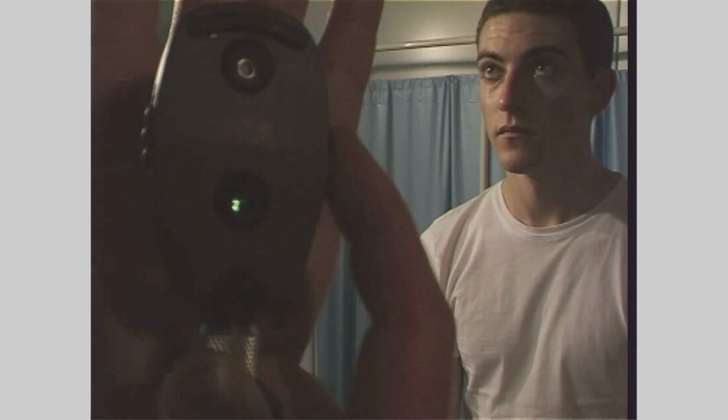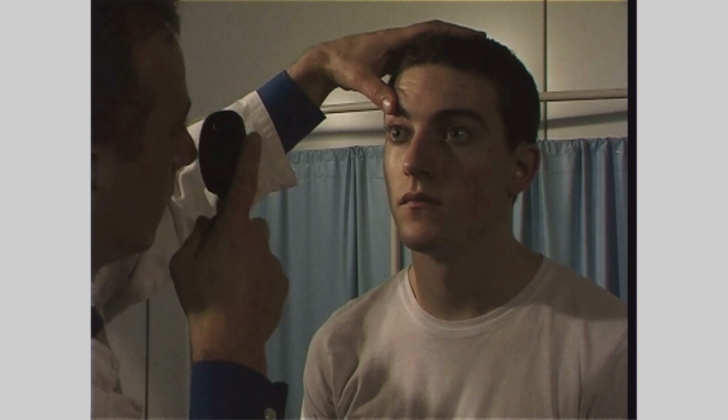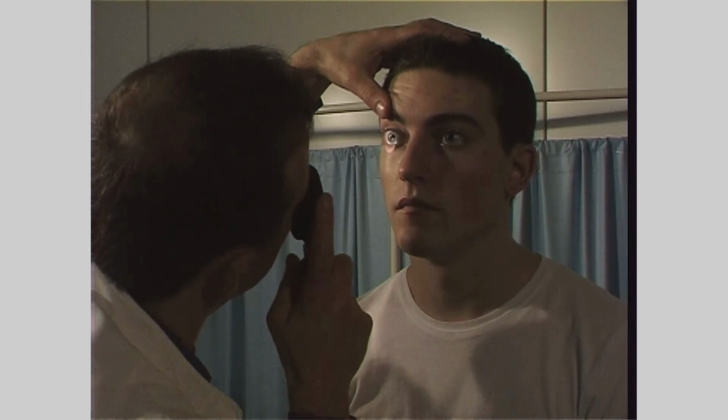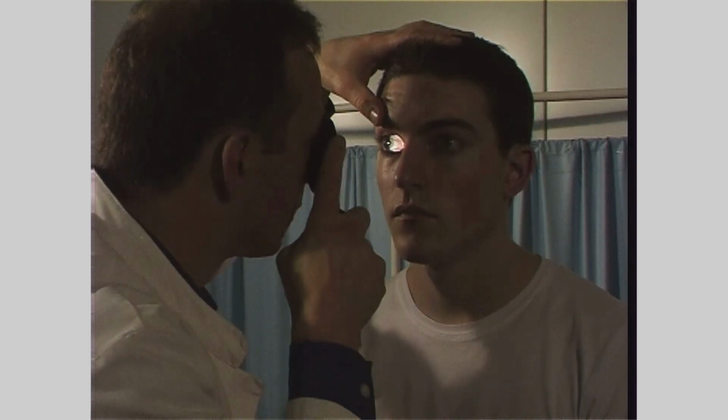Next, examine the fundi of the eyes. Refer to the use of equipment menu for a full description on how to use the diagnostic kit. Set the ophthalmoscope to +10 diopters to examine the anterior portion of the eye, gradually reduce it to 0 or until the retina comes into focus.